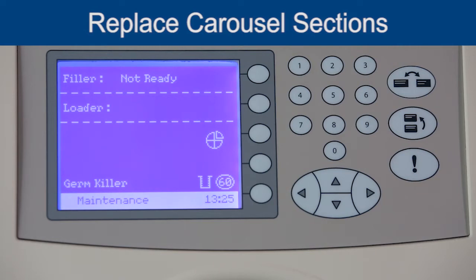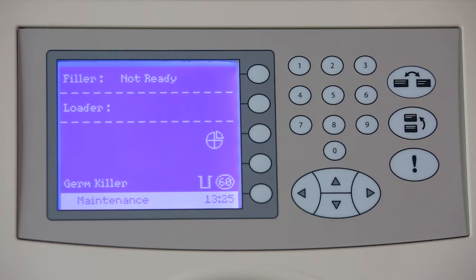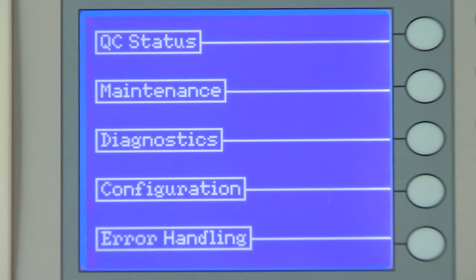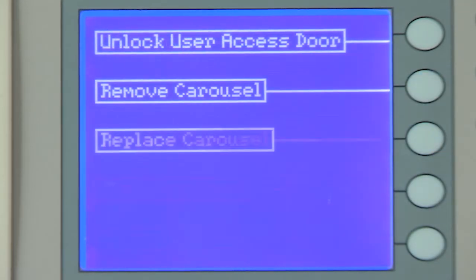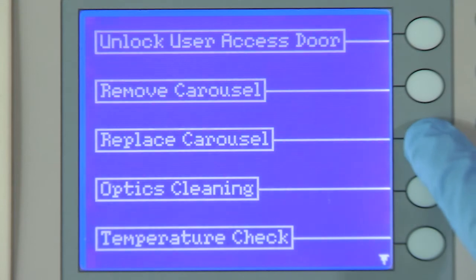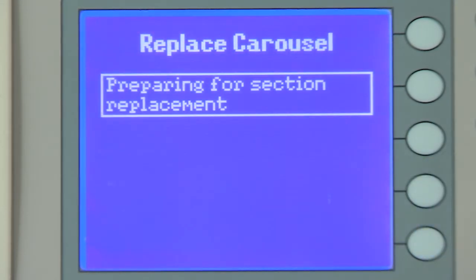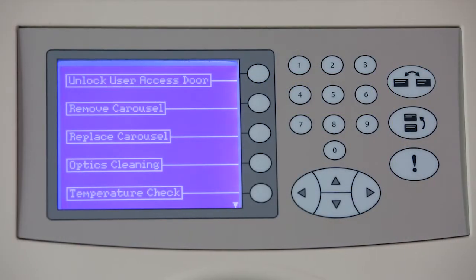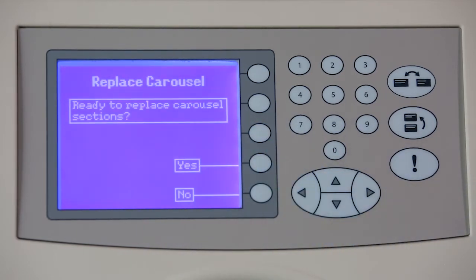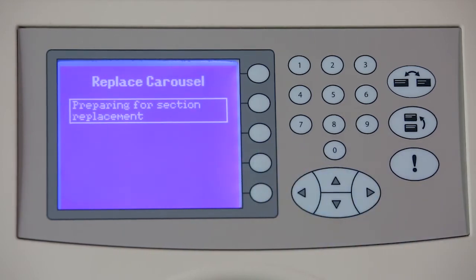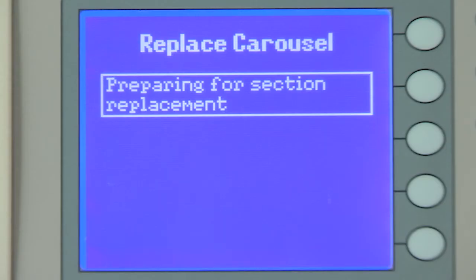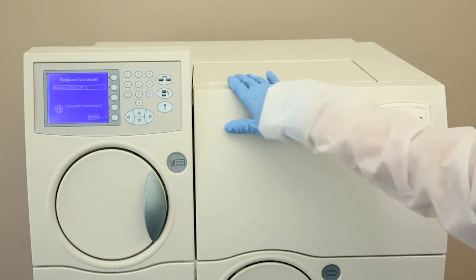To reinstall the carousel sections into the instrument, press the corresponding function keys in the following order. If at the Status screen, first press the Status Menu key, then press the function keys for Maintenance, followed by Replace Carousel, and finally Yes. If at the Maintenance screen, press the key for Replace Carousel followed by the key for Yes. The following message displays: Preparing for Section Replacement.